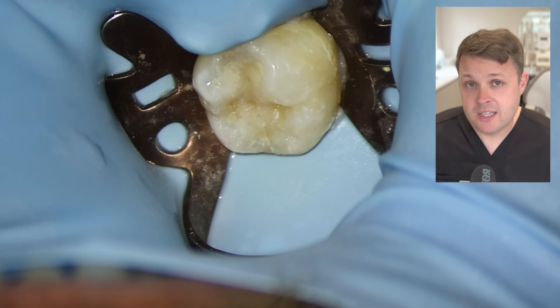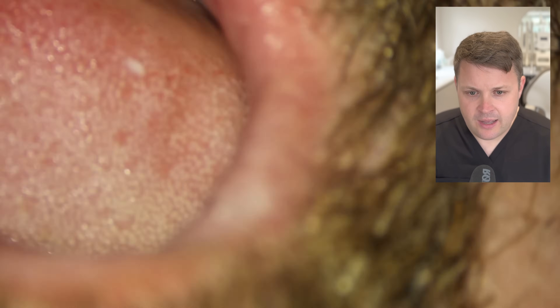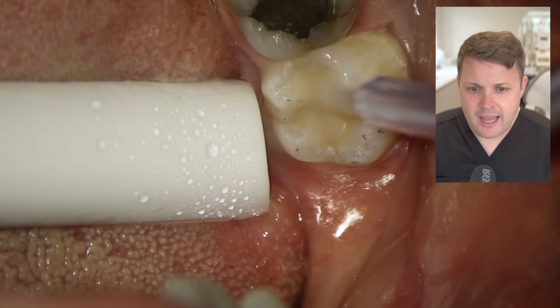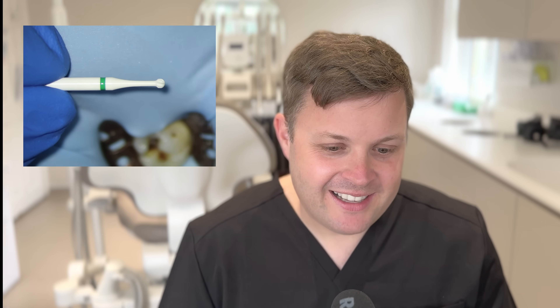The last thing to do is check the occlusion. We remove the rubber dam, get the patient to bite down, and it looks relatively nice — I'm very happy with this. If you're interested in ceramic burrs, these are from Comet. I discovered them at the dentistry show where someone showed me all these different types of burrs — I saw this white burr and thought 'what's this?' and the rest is history.